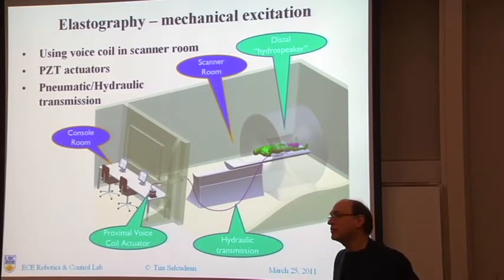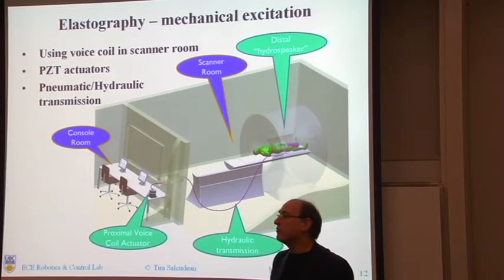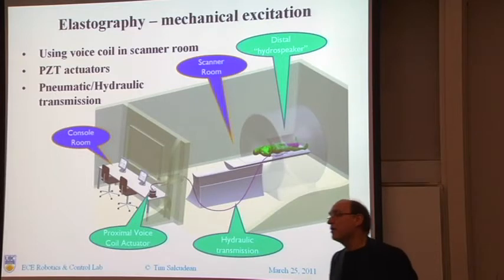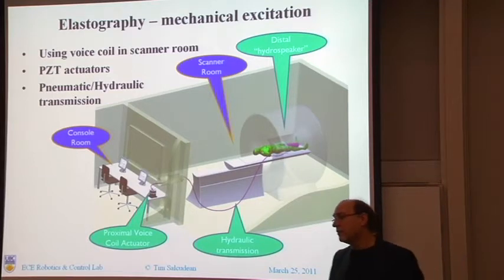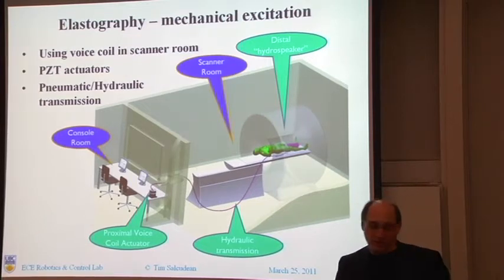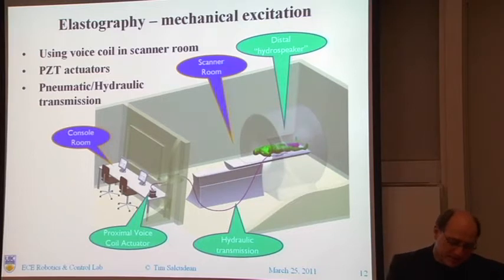That's not true. You can get contrast in elasticity, which has been shown in brain tissue, for example, all the way from 50 to 800 hertz. And the properties are consistent with linear viscoelastic models when you use small excitation, and you get actually power law, and everything is amazingly beautiful. Is the picture the same at 50 and 200? No, no. The elasticity can be the same across frequency, but you're jumping ahead. I'll show you.